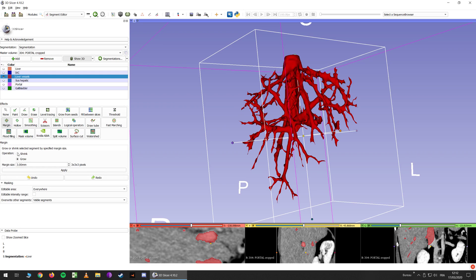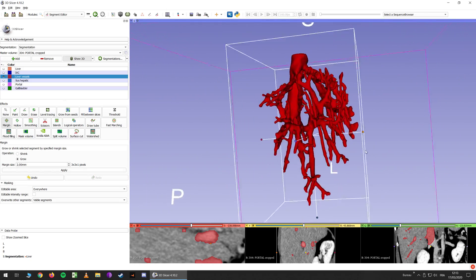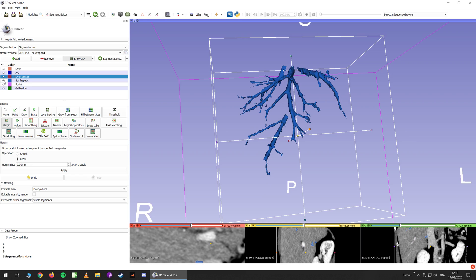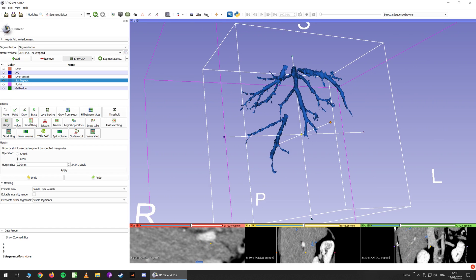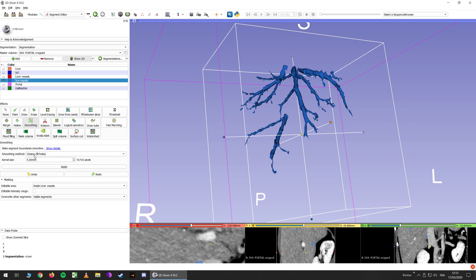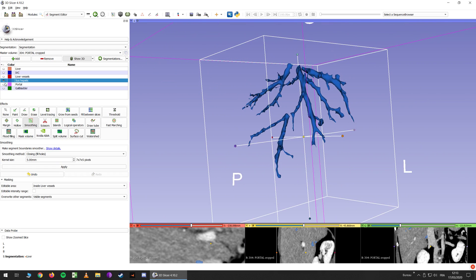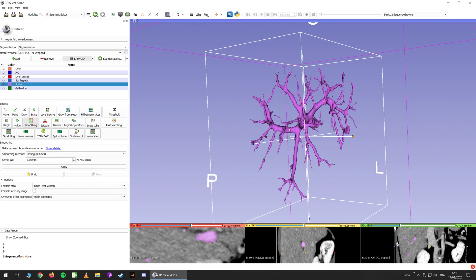Now you can grow your segment a little bit — not too much, 2 mm is fine. So now you can work only in this area. Click here and you are going to work in your subhepatic segment. In the editable area, you want to click inside liver vessels, which is the segment you just changed a little bit. Now go to smoothing, do closing fill holes, and click apply. Now it's a little bigger. You can do the same for the portal segment closing — as you can see, it's a little better.